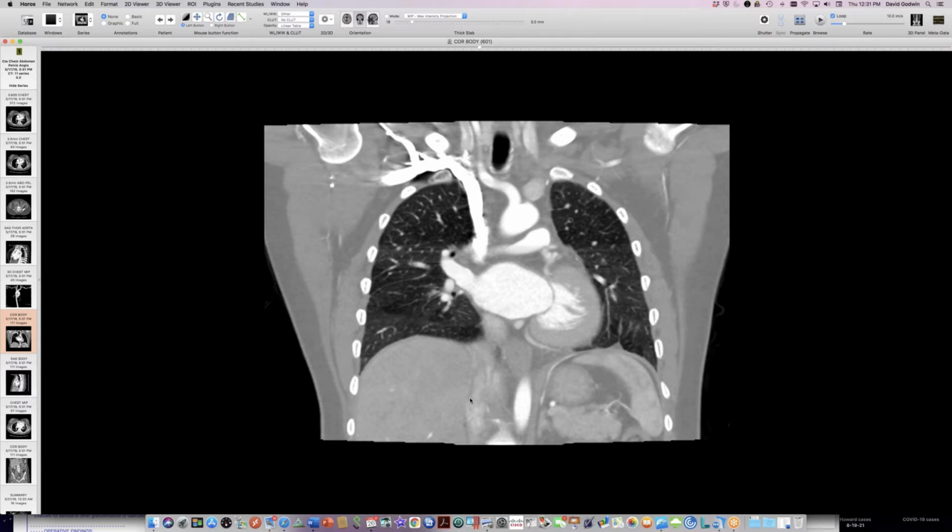Okay, and then I wanted to revise a case that I showed a couple of weeks ago. It was a newborn with what looked like left upper lobe bronchial stenosis. There was a mucus plug and hyperlucency in the left upper lobe, and also a mediastinal cyst, a subcarinal cyst. I have subsequently gotten the path. What I thought was a bronchial atresia in the left upper lobe, the pathologists at Children's Hospital are calling a CPAM type 2. So that was wrong.